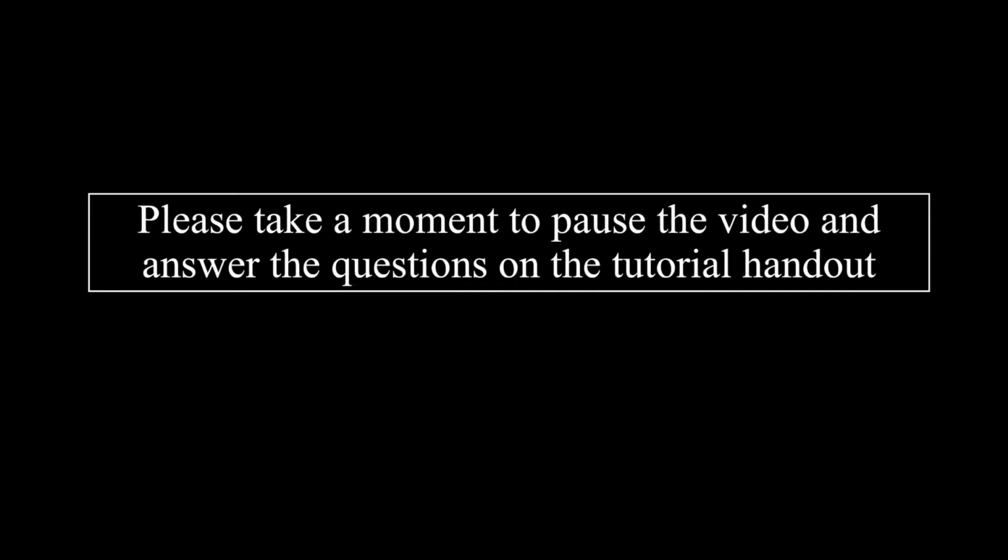Now, please take a moment to pause the video and answer the questions on the tutorial sheet. Question 4. Why is the cluster correction result subject to change each time you run it? Question 5. How could we compare the faces minus scrambled condition to the faces minus body condition when both of these will yield different cluster values? Try performing the cluster correction yourself for both of these conditions to compare them.